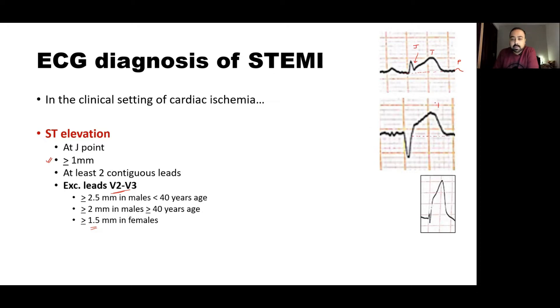Looking at ECG examples: you can identify the T wave, P wave, and TP segment. The point where the QRS complex ends is the J point. You can see significant ST elevation above the baseline. In the next example, where the baseline is not linear, we can roughly consider the PR segment as the baseline. The J point is identified and there are massive ST elevations — this is a tombstoning pattern of ST elevation, examples of STEMI.